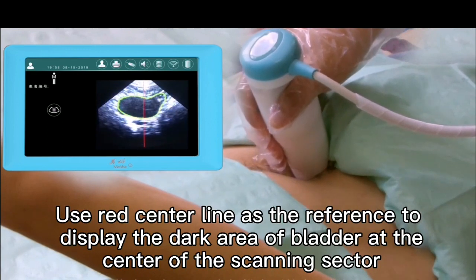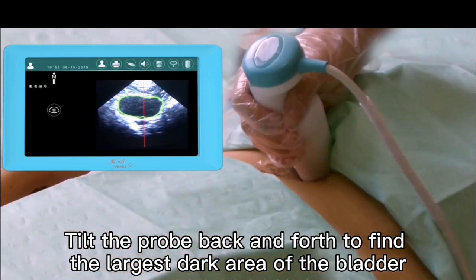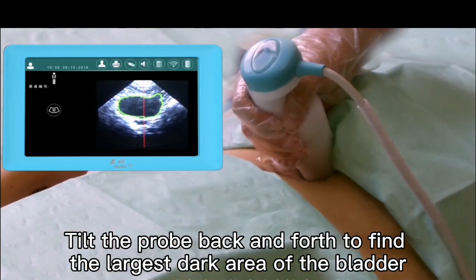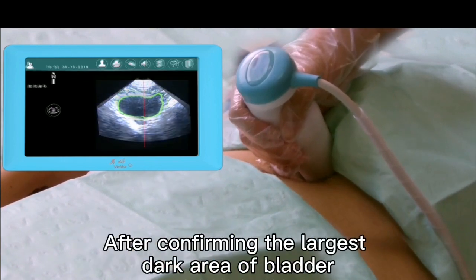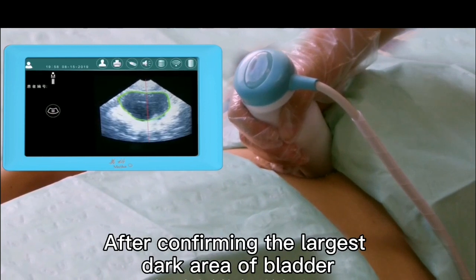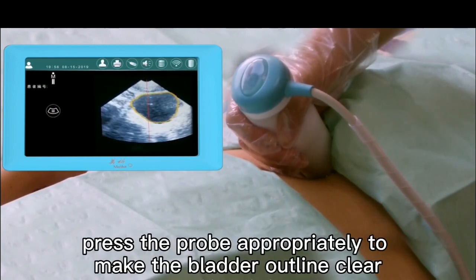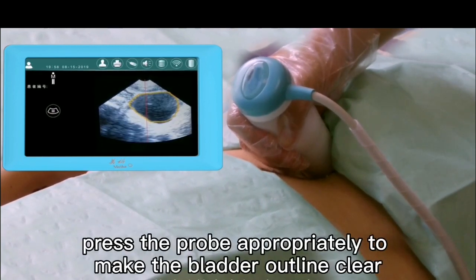Tilt the probe back and forth to find the largest dark area of the bladder. After confirming the largest dark area, press the probe appropriately to make the bladder outline clear.